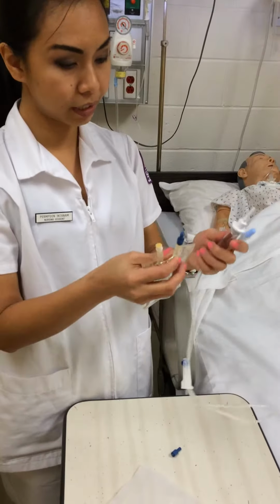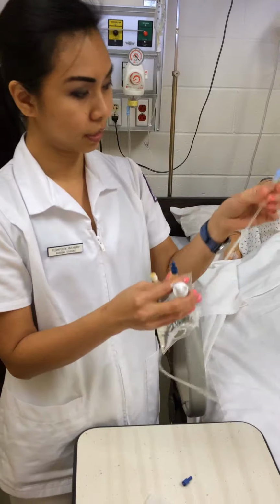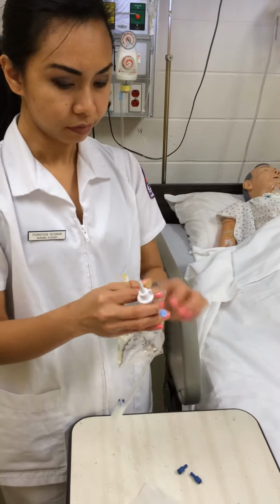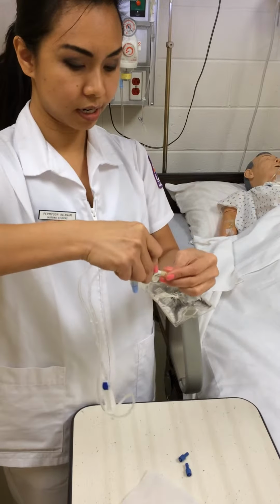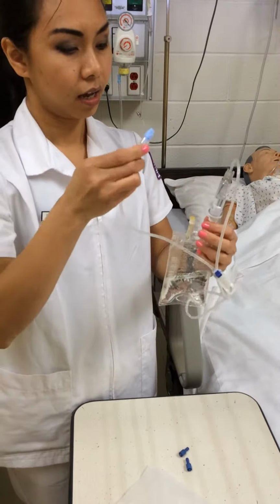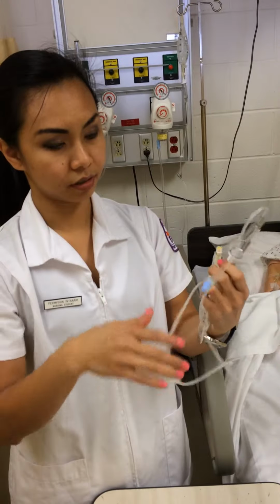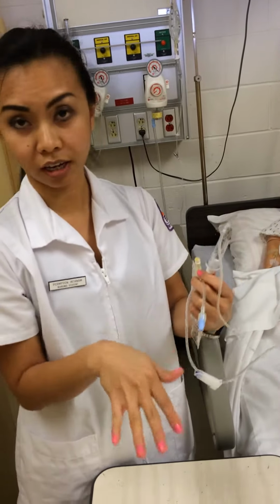So after I put the label, I prepare my tubing. This is sterile, so I open it and I clamp it. Okay, I make sure that the tube is clamped so the medicine does not come out.